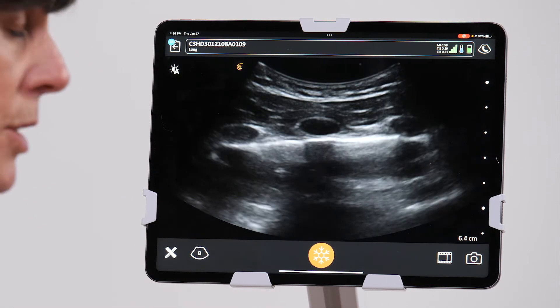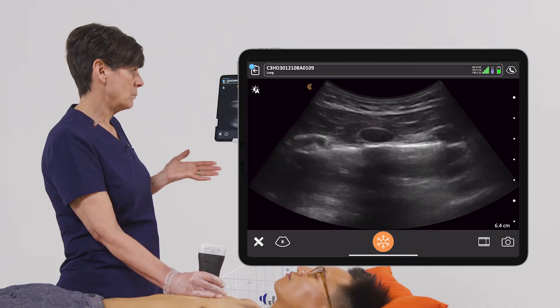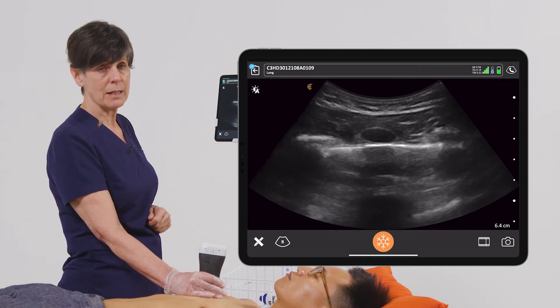We're going to turn that on and you'll see how that changes your image. For some people that's much more diagnostic, and for others maybe not, but that option is there for you to optimize and customize your imaging.